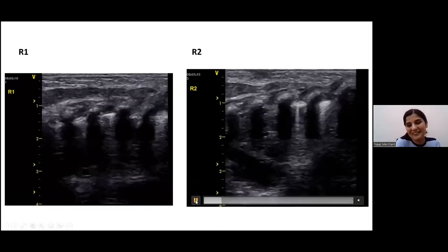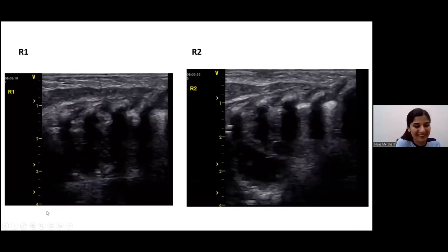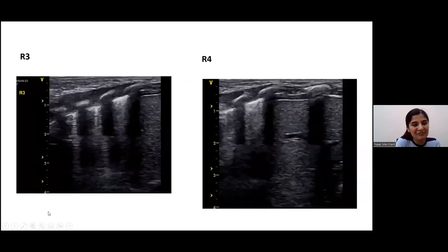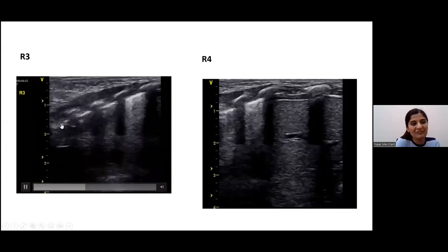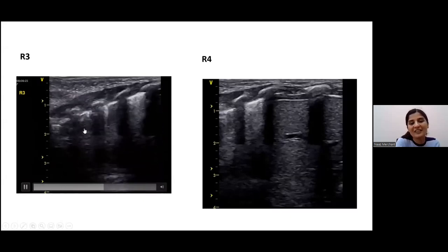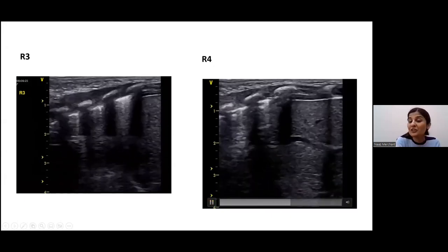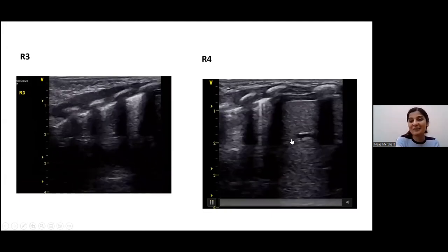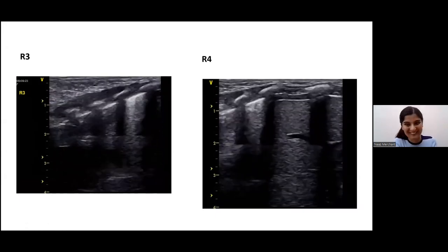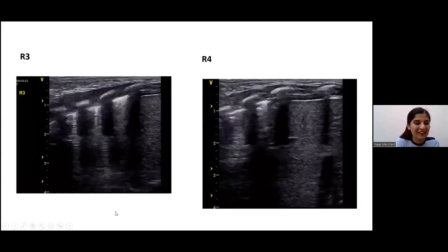And you can see the same thing, the heart was just coming in the way, and even on the axillary side. So mainly an A profile, but then again, some B lines. So essentially it seemed more transitioning. You could see the liver actually on that side with the nice duct over here. So actually it wasn't situs inversus on the lung ultrasound on this, but there was clearly dextrocardia over here.